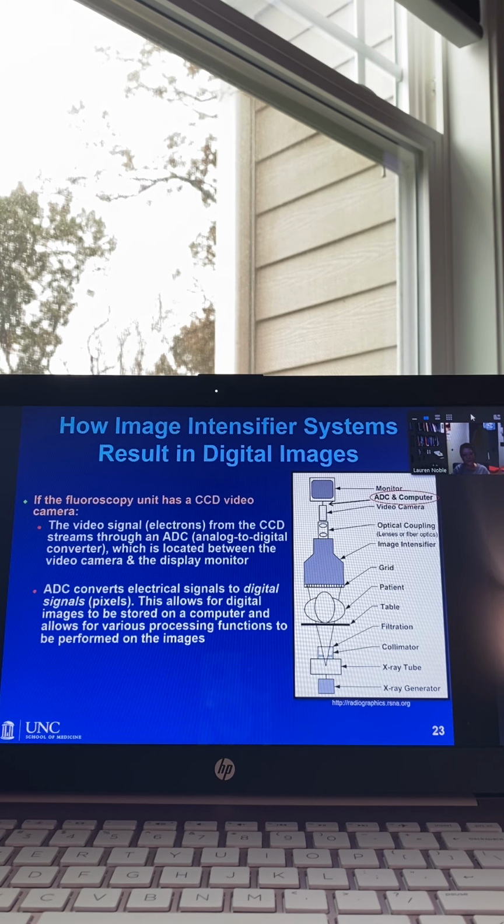It's something like 99.9% of facilities now have digital imaging. So anyway, even our unit down in the lab, our TV camera isn't a Vidicon, it's a CCD.